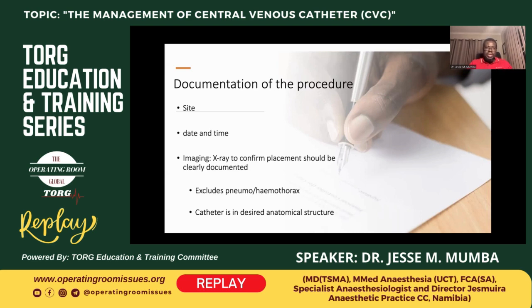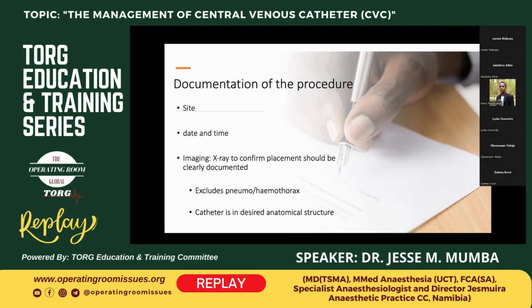And also the other thing that is a must that we do is upon insertion, we want to make sure that we have the catheters, or the tip of the catheters, in the central venous system where it's most effective without other complications. So we always order a chest X-ray. In an emergency, like in theater, we insert them and we use them, but even then, as the patient goes to the ward, the recommendation is that they should have a chest X-ray done and reported on, so that you can exclude things like pneumo and hemothoraces.